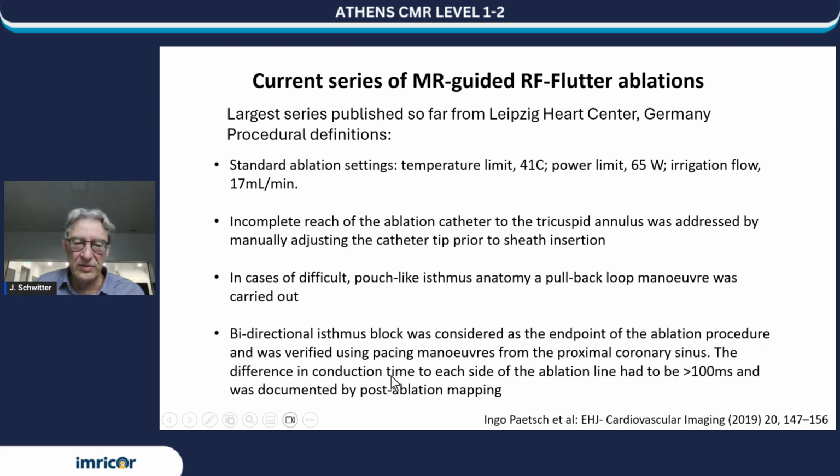if the conduction between the 2 points was through this line with a more than 100 milliseconds delay time, as you shortly explained during the video. So this was here the endpoint. The procedural endpoint was a bidirectional block through the isthmus line. I think in the future, in the left ventricle, inducibility of tachycardias will be the endpoint, or imaging endpoints. If you see that you have completely ablated the point in the myocardium, that could be an endpoint, but here it's an electrophysiological endpoint.